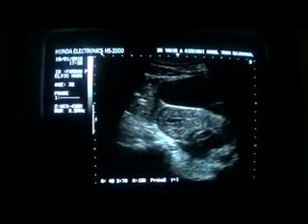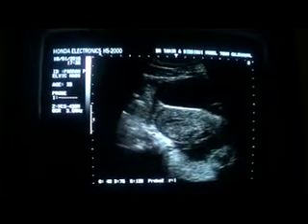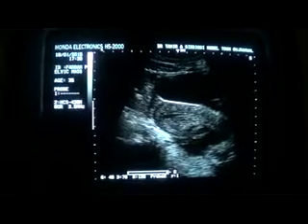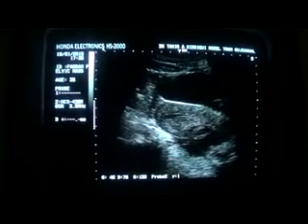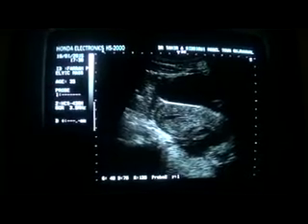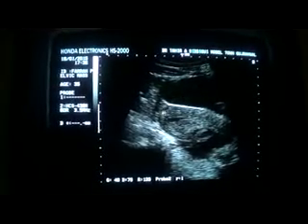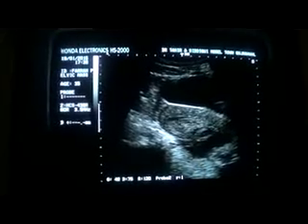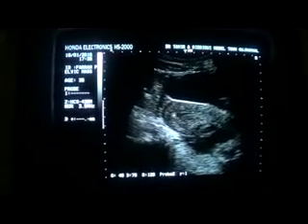This is an ultrasound study of a 35 year old female presenting with a history of pain in the rectum during defecation and otherwise as well. Now, in view is the urinary bladder, anterior myometrium, posterior myometrium, and the cervix. This is the endometrial canal, fluid filled.